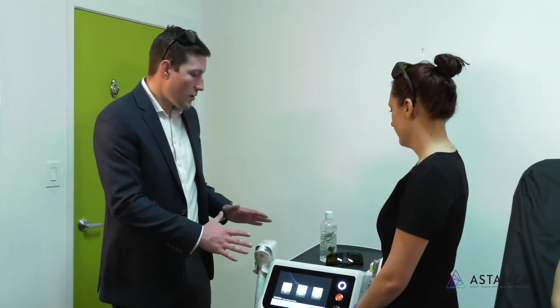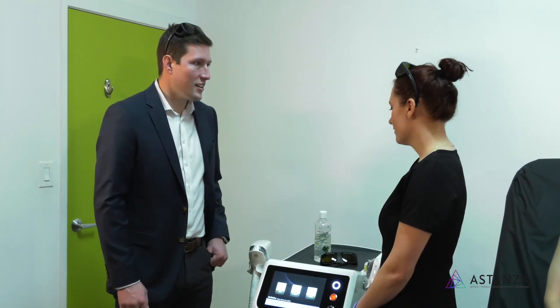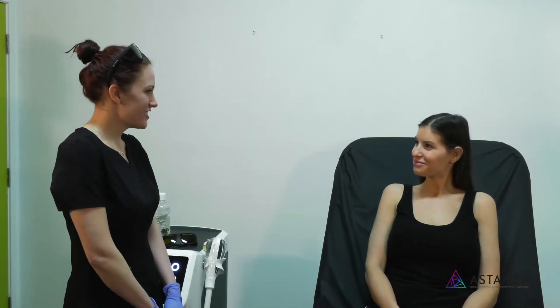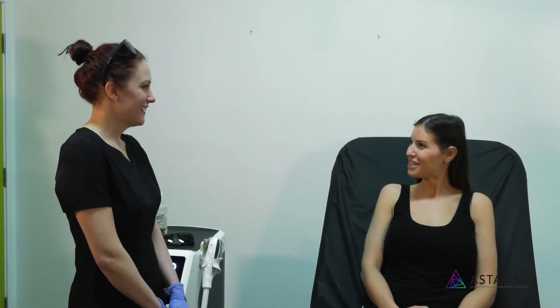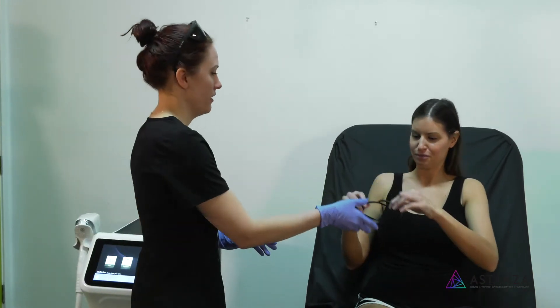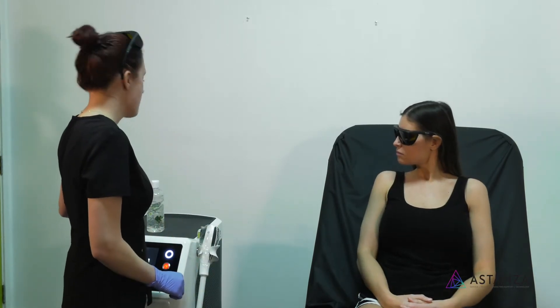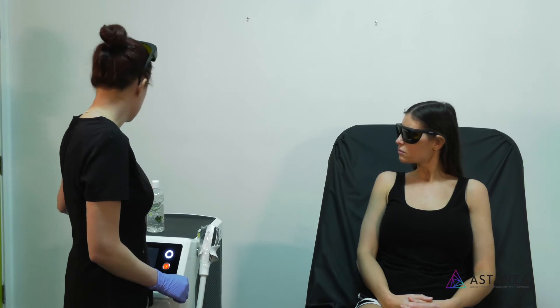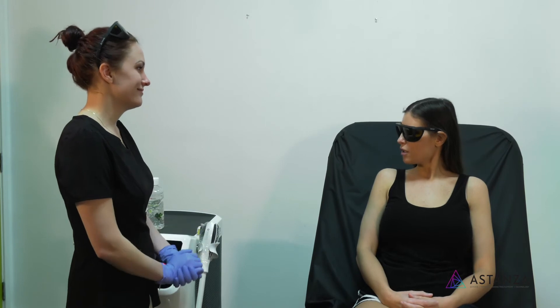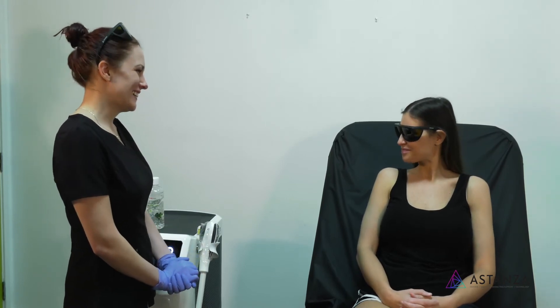Getting the machine ready to rock and roll. Holly meets her patient: Hi, I'm Holly and I'll be your practitioner today. Hi, I'm Whitley. Nice to meet you. Holly provides protective goggles and explains that the Monolith XL has 360 cooling around it, which should make the treatment really comfortable. Whitley says she's excited and has no questions, so they get started.